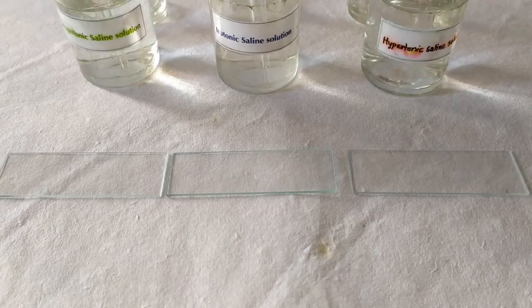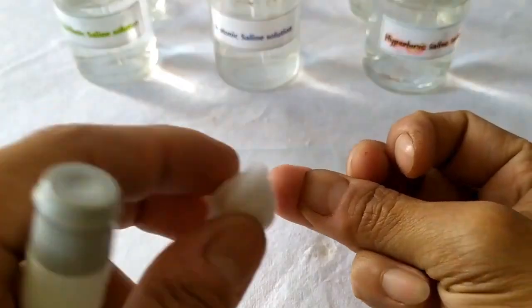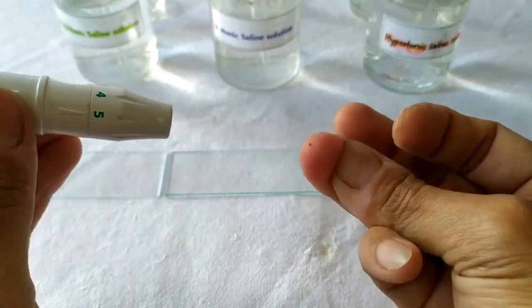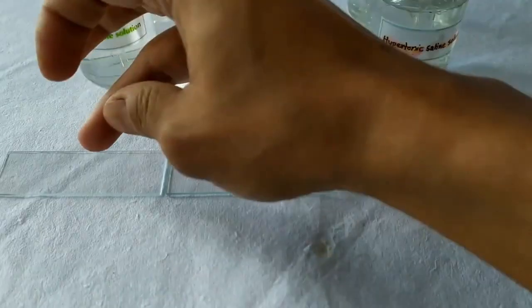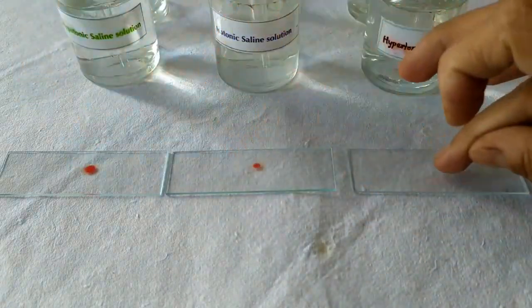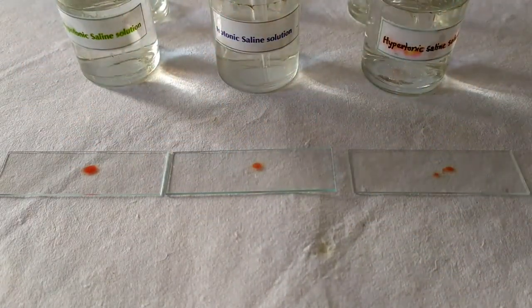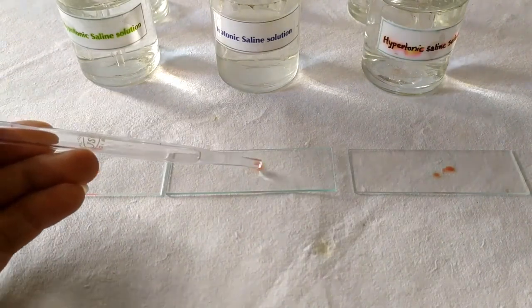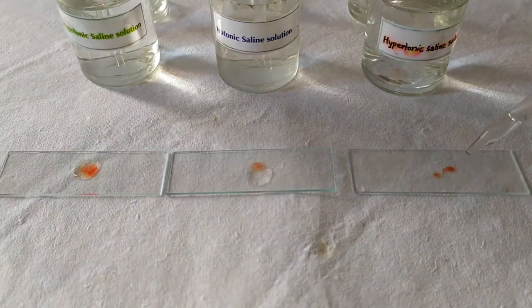Begin the experiment by taking 3 clean and dry glass slides along with the 3 different tonic solutions with a dropper in each bottle. Clean a finger with alcohol and prick it using a lancet or pricking device. Place a drop of blood in the center of each slide. Place a drop of hypotonic, isotonic, and hypertonic solution on the drops of blood in each of the 3 slides.